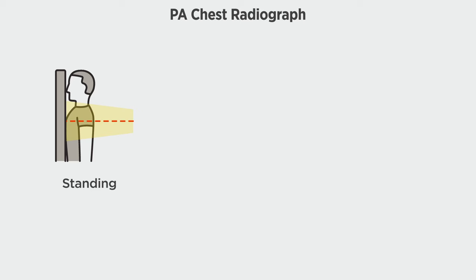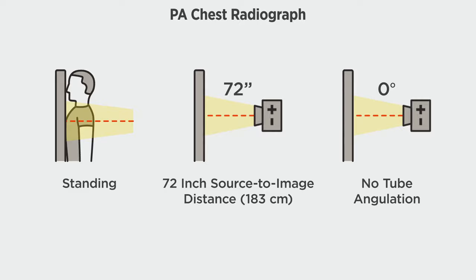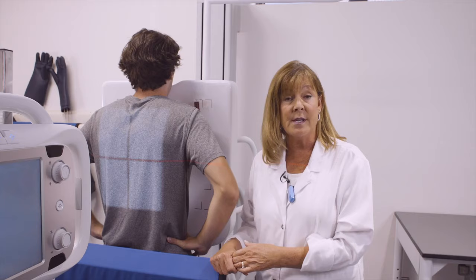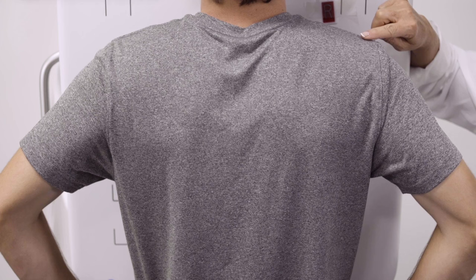In this view we will be demonstrating a PA chest. The PA chest should be performed with the patient standing at the upright bucky with a 72-inch source to image distance and no tube angulation. Our heart lies anterior and a little to the left, so we will always want the heart closest to the IR to reduce magnification. I have him PA at the upright bucky, with the IR one and a half to two inches above his shoulders, using the mid-sagittal plane and T7.